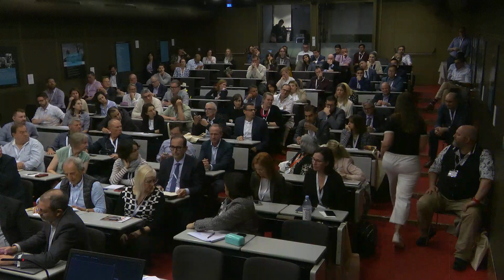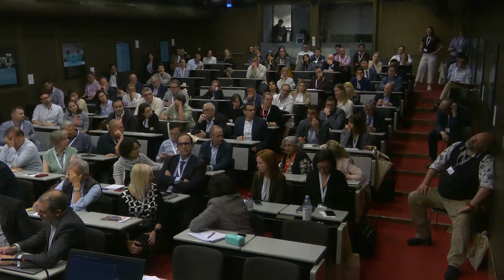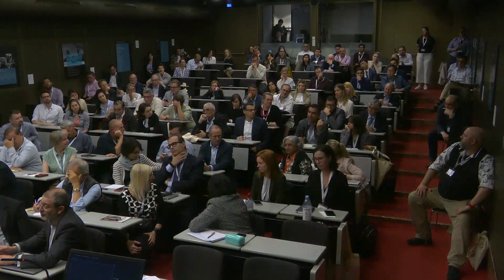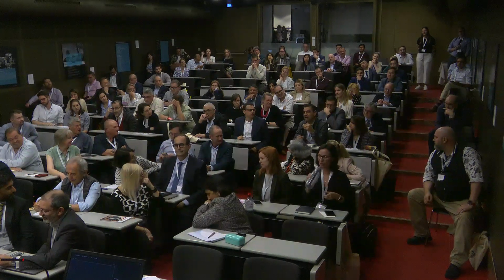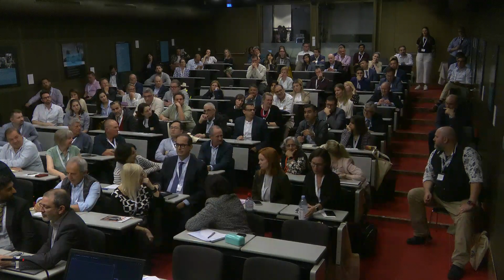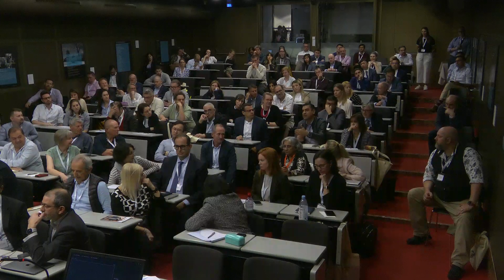Yes. Enrique Cos from Mexico. I think that this mixture of tests we have in the options, in the supine or in the upright position, if we do the whole protocol all the way, I think it will last more than my trip from Mexico to here. So I would like you to say who is performing the esophageal manometry at your site. If there is a doctor performing the manometry, then they can ask the patient what the main problem is, so they can perform this series of provocative tests.